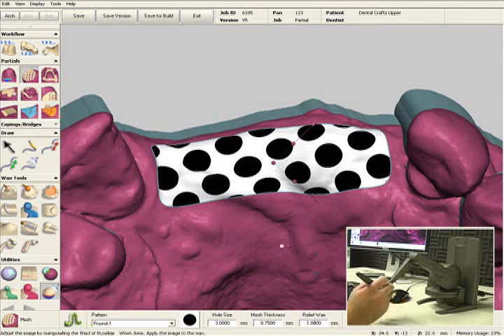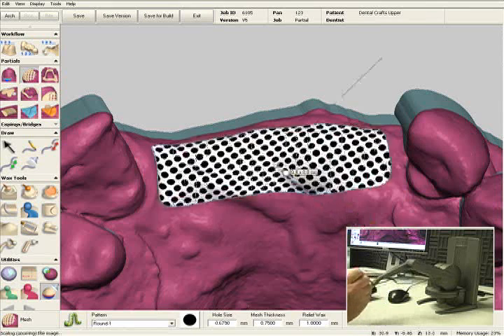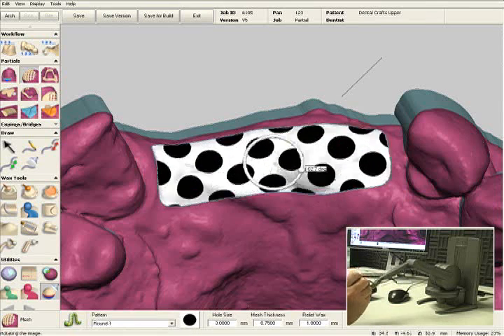You can also change the hole sizes manually. You can grab the arrow here, you can make your mesh larger or smaller, and you can rotate the mesh.